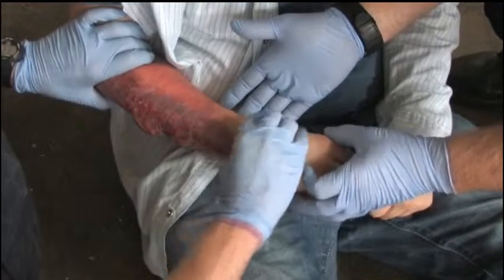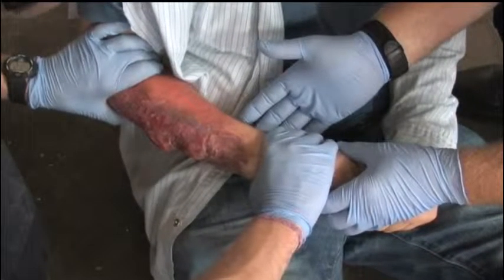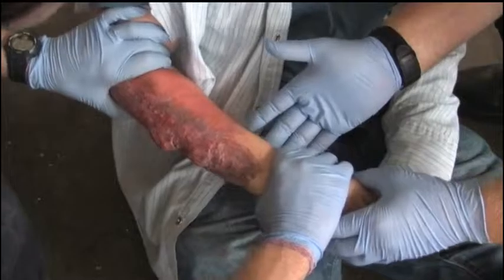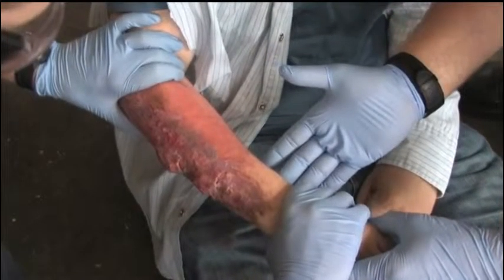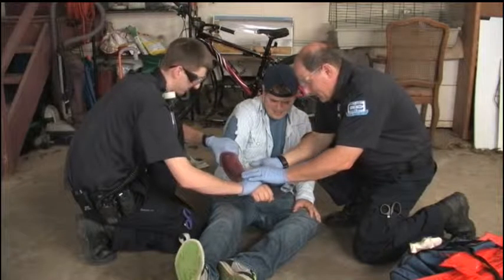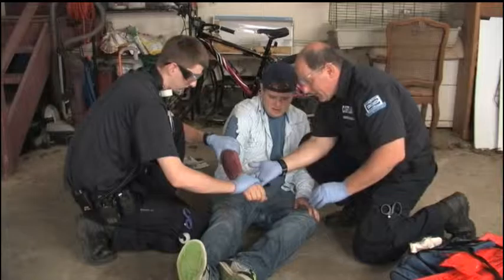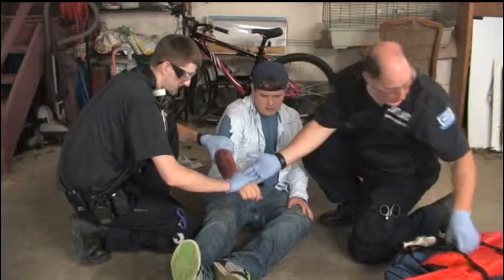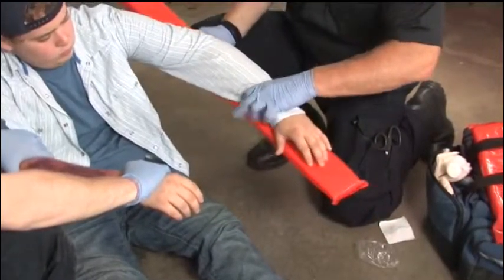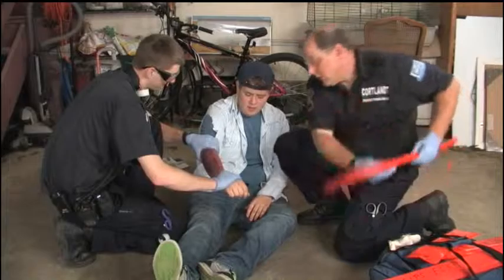Realign the injury if deformed or if the distal extremity is cyanotic or pulseless. Continue until you achieve neutral alignment or the return of circulation. If you feel resistance, stop realignment and splint the deformed injury in place. Measure the splint to several inches beyond both joints, above and below the injury site. Measure the device on the opposite extremity if possible to avoid bumping and/or further injury to the extremity.